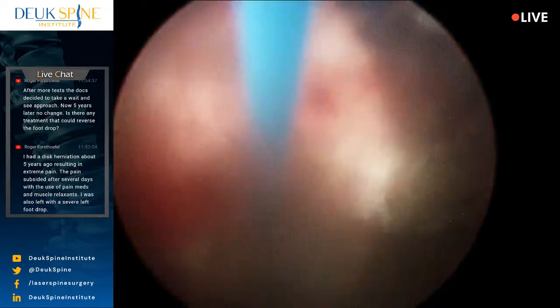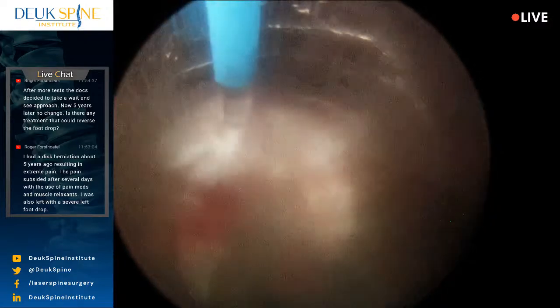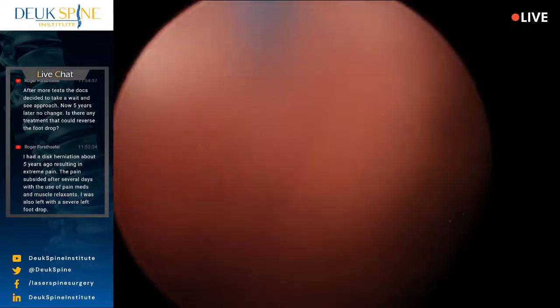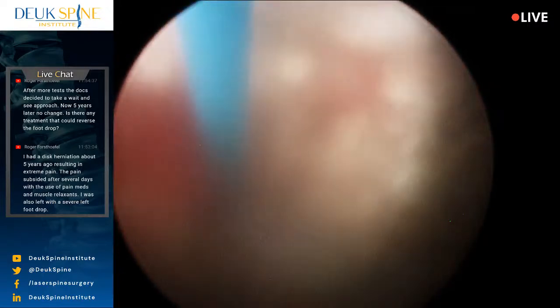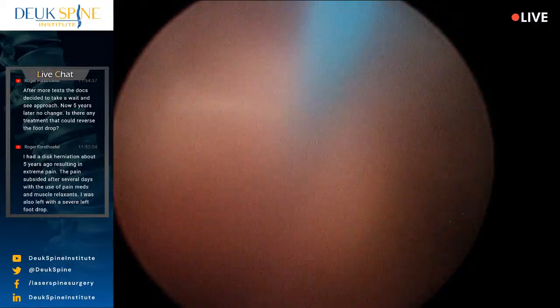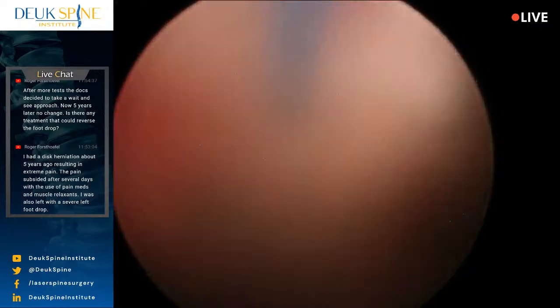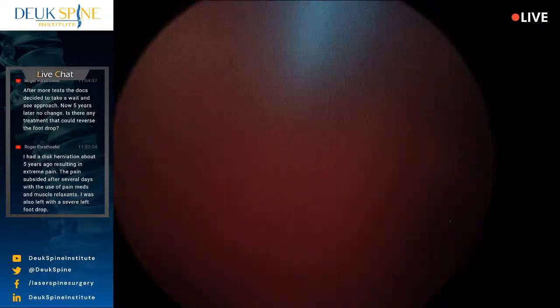The reason there's some bleeding here is, remember what I told you earlier, this is an inflammatory condition. So she had compression, but all disc herniations are inflammatory, meaning they elicit inflammation. And inflammation brings blood flow, blood supply. So it's the inflammation that makes it bleed. Just like a zit is red and swollen because of the inflammation. There's blood there. This is like an aseptic zit in the lower back.